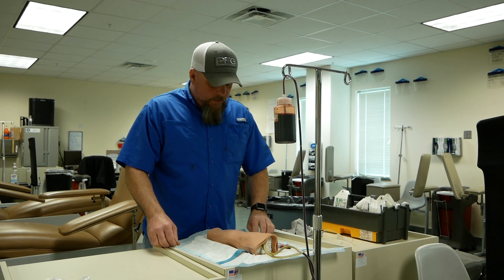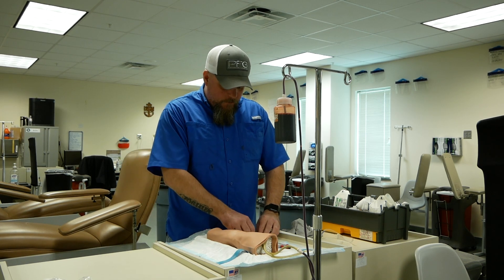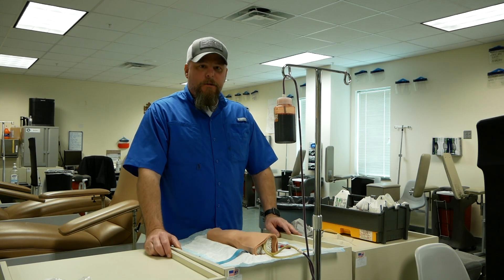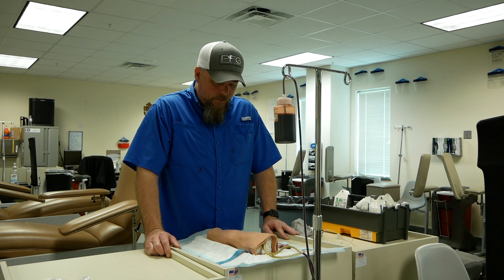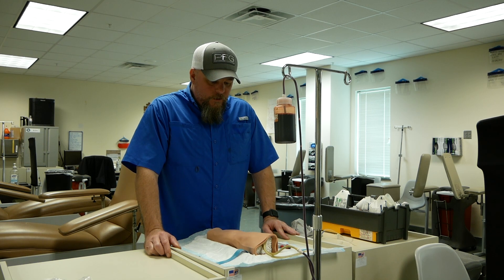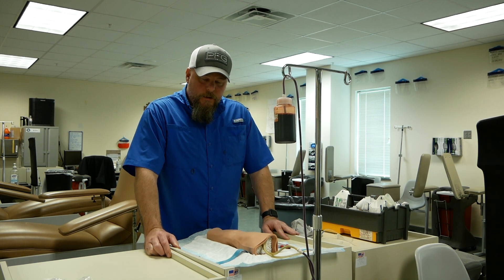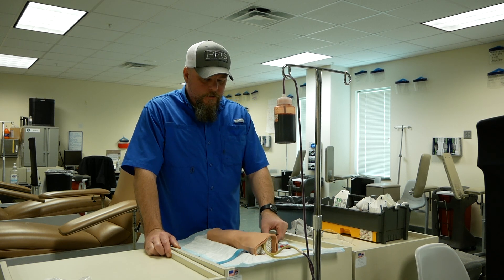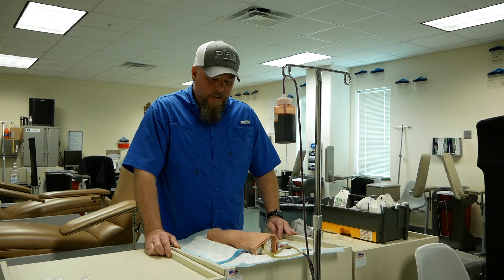The only thing missing from this is tape and we're not going to put tape on the mannequin arms. After that, you want to introduce yourself. Once you introduce yourself, you're going to get two patient identifiers, which is their full name and date of birth. Then you're going to explain your procedure, answer any questions, and obtain consent. After that, you're going to ask them if they have any allergies, then wash your hands and don BSI.